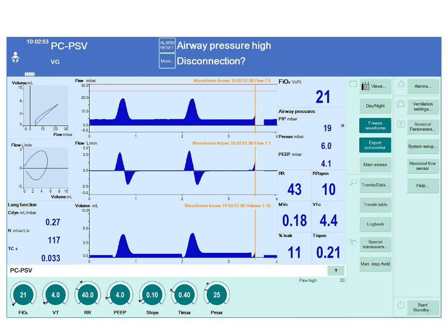Which we said it should be 4 to 6 mL per kilogram. So if the baby is 1 kilogram, for example, like in this picture here, it will be only 4 mL, okay? That's your rate, and that's your PEEP, and followed by that is the rest of the numbers, okay, what you said, basically.